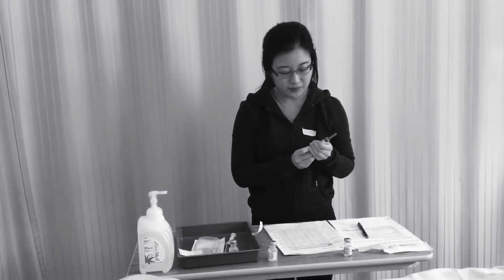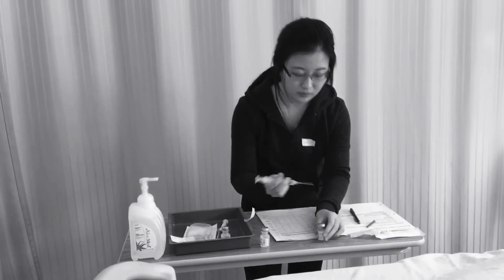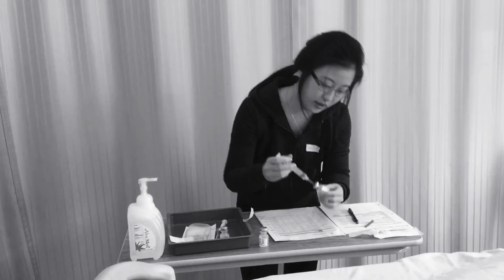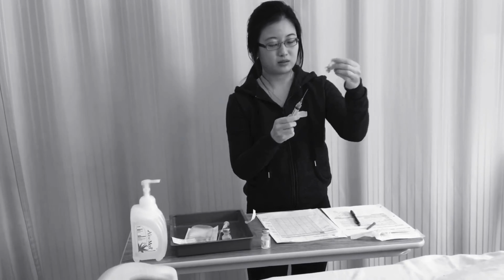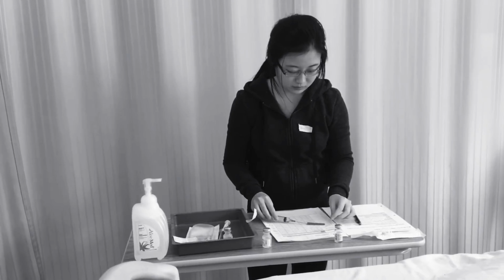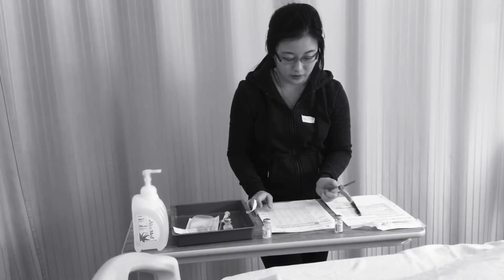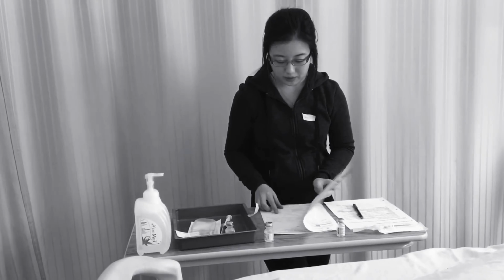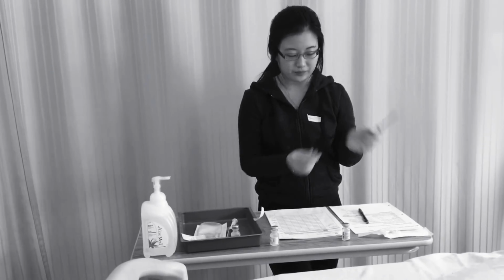Alcohol swab, 30 seconds. Let it dry. Take out 1.6 of air that I need, and I'm going to get that out from my vial. So that is 1.6, and make sure there's no bubbles. And I'm going to check my dosage against my MAR before I dilute it more. So it is 200 mgs, and I'm going to double check my calculation. Cross multiply is 1.6, and I have 1.6 in here.